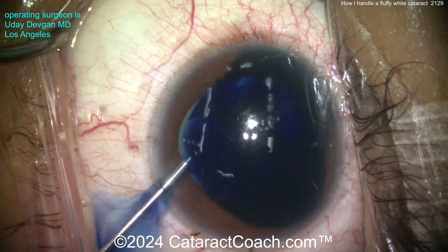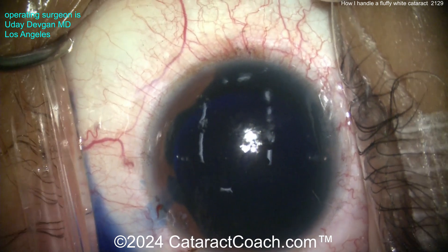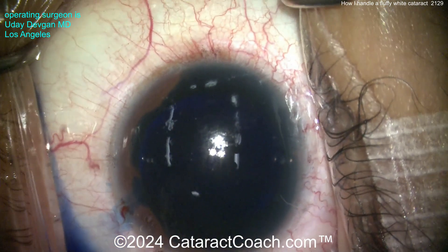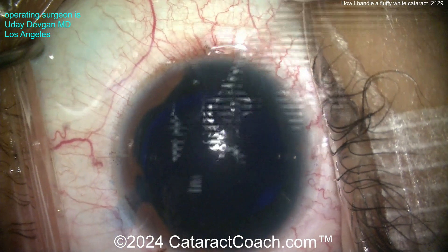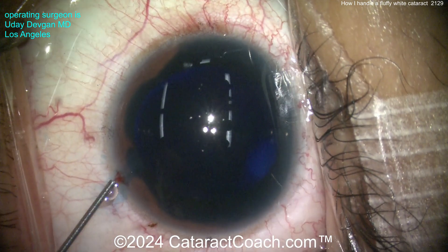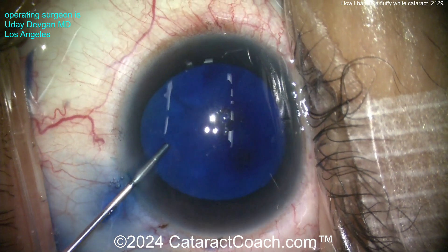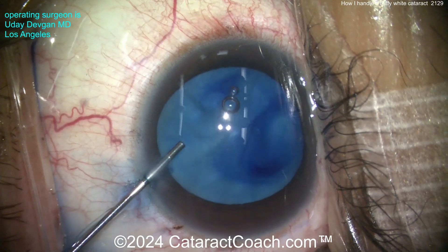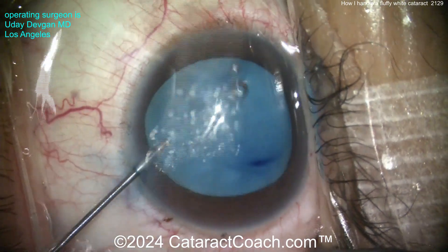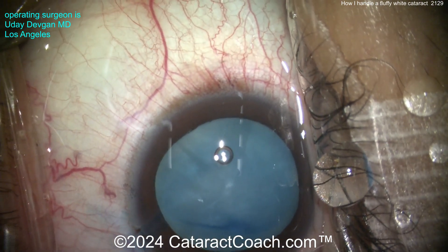Let me show you my technique for doing these soft white fluffy cataracts. This patient is young, mid-30s, and had trauma to this eye that developed into this cataract. We put TriPen Blue dye in the eye to stain the anterior lens capsule — that's important. It also makes the capsule a little bit less elastic. Now diluting that out and putting in some preservative-free lidocaine mixed with balanced salt solution for additional anesthesia. We can see there's a pretty good stain.